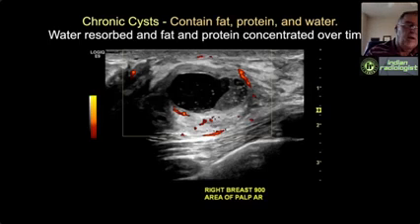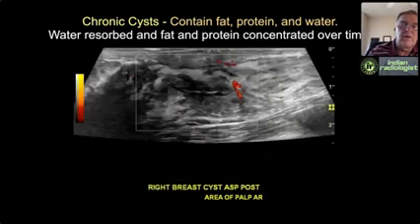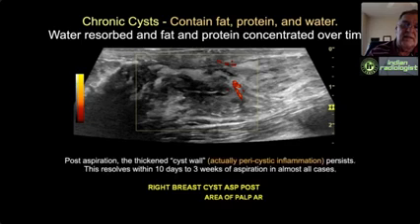Any sort of tear or rent of the epithelium lining the cyst wall can allow this inflammatory lipid content to come in contact with the surrounding tissues and cause acute inflammation. So this is actually very common. Now when you aspirate these cysts, they aspirate completely, but the pericystic inflammation persists. So you can see this little white line represents the two walls of the cyst completely enclosed. I've taken every drop of fluid out of this, but what I have is residual pericystic wall thickening.